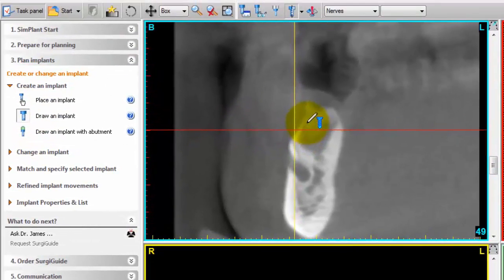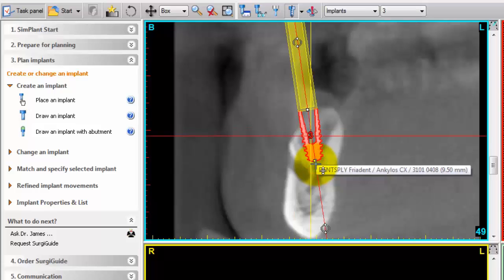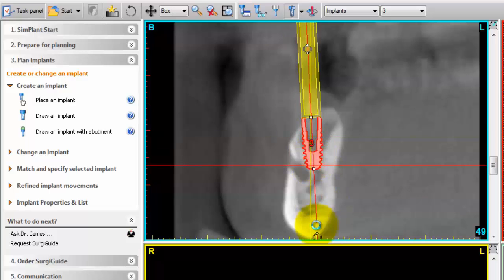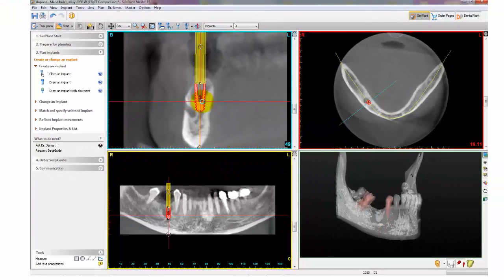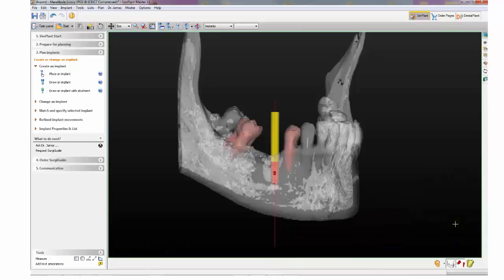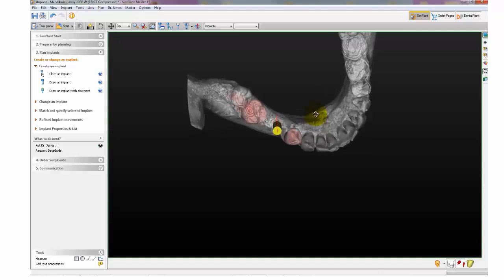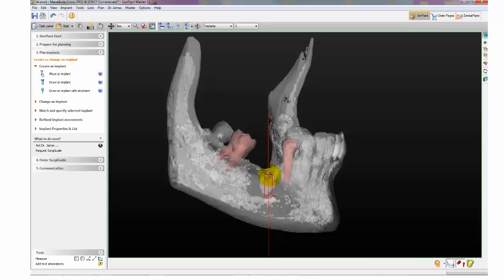Start off from the crest of the bone and drag the implant downwards. You can use the rotational tools to refine the implant placement. You can also left click and hold down the implant to adjust the position. Once the implant is placed, you can verify its position within the 3D view or the other views within the plan, such as the axial or the panoramic view.